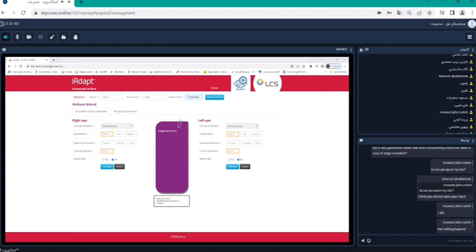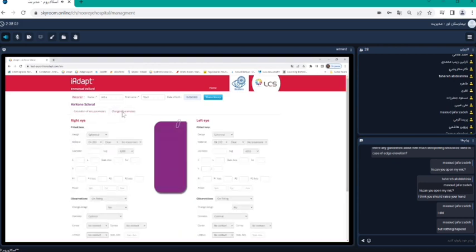But if you want to solve the case we saw earlier, the one with the parameters I showed you, that was this one. So you can specify change of parameters. You just specify the parameters of the lens we were inserting. We had a toric lens. We specify the diameter, that was 16.5, a sag of 4,300, and a power of +2.